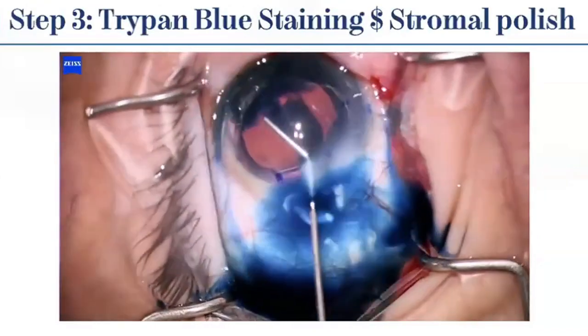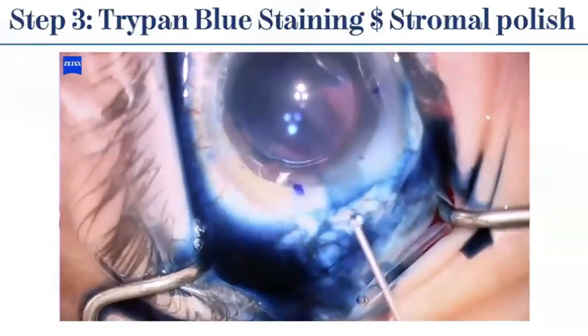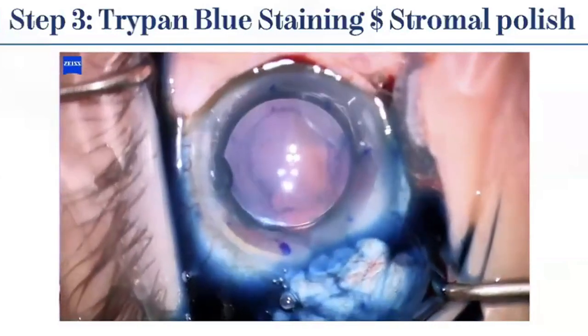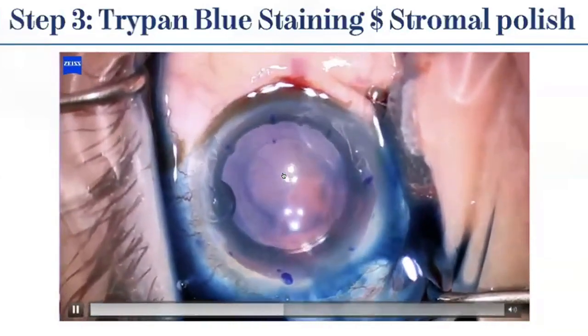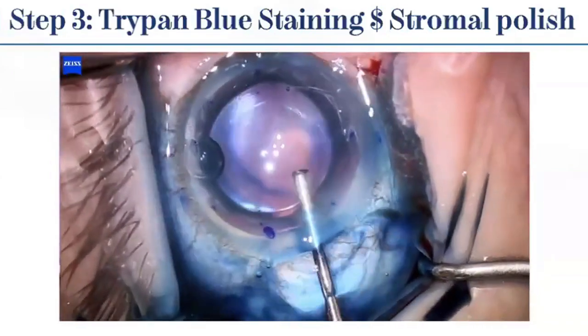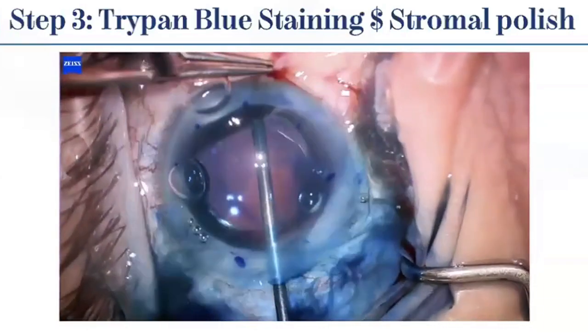Step 3 is to inject trypan blue, and then we will re-inject viscoelastic to help visualize if we have any residual Descemet. In this case, we don't have any residual Descemet, so now we will use the Terry scraper to polish the stroma 360 degrees. What this does is roughen the surface for better graft attachment.